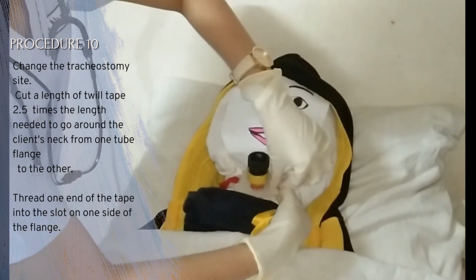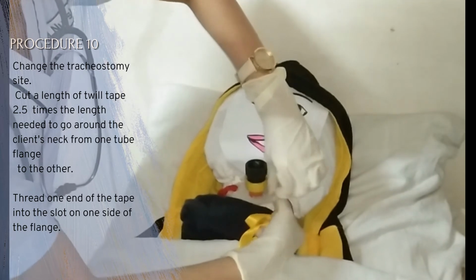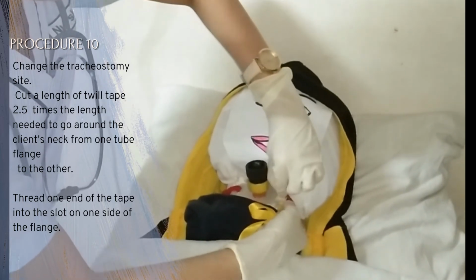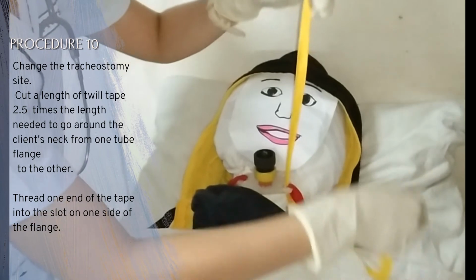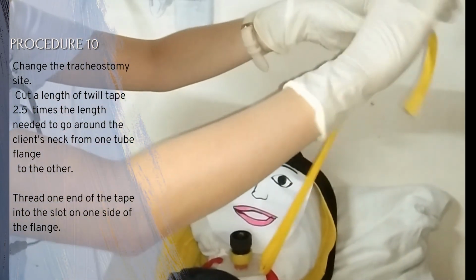Cut a length of twill tape 2.5 times the length needed to go around the client's neck from one tube flange to the other. If the tape is too loose, the tube may move and cause bleeding and granulation, and the tube may fall out easily. Cutting one tape longer than the other allows them to be fastened at the side of the neck for easy access and to avoid the pressure of the knot on the skin and at the back of the neck.